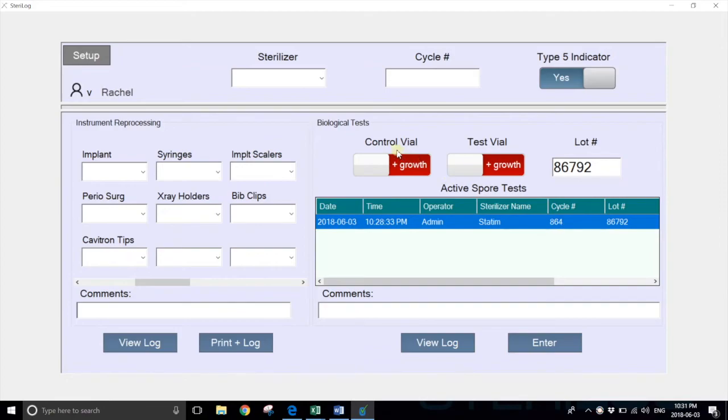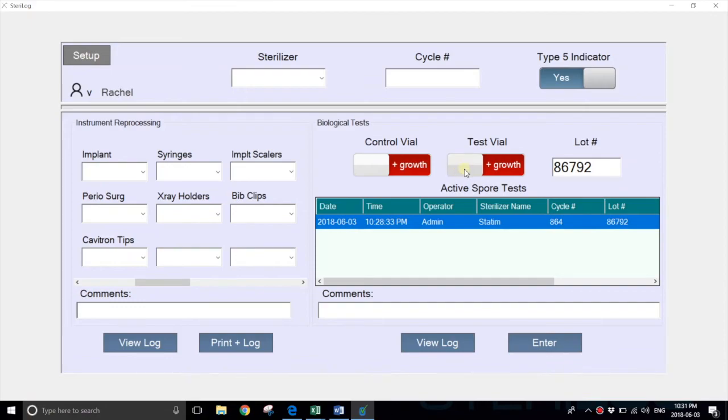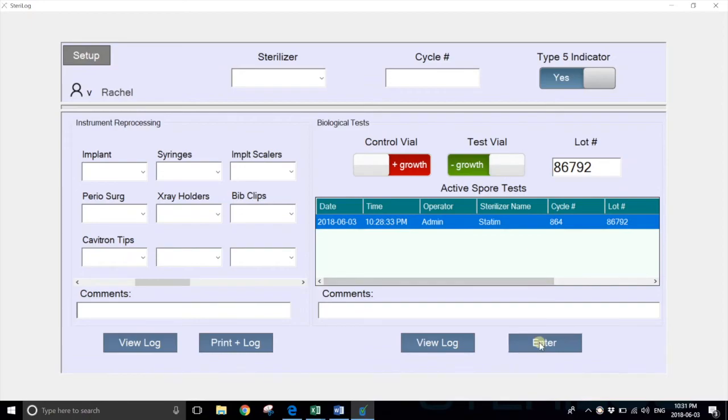Here you can see there are two toggles, one for the control vial and one for the test vial. If the test is passed, the control vial would have positive growth, and the test vial would have negative growth. The user would set these as such and simply hit enter.